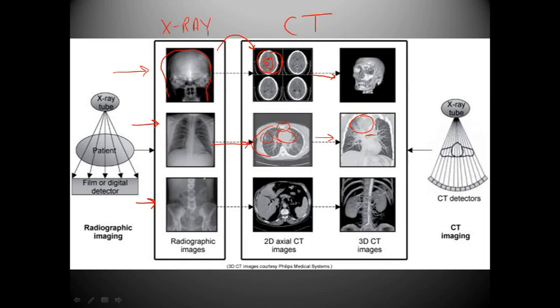basically, I guess you would call this a KUB without being able to really differentiate where the kidneys are. We're up to about T12, T11, and so that would suffice for a KUB. And we have stomach air here, a little bit of air, and probably the cecum or ascending colon.